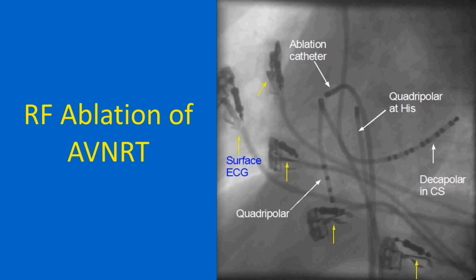The distal electrodes record the potential from the left atrium. One quadripolar catheter is positioned in the region of the bundle of His and another in the right ventricle. All electrode pairs are connected to a junction box and through it to the EP recorder. Recordings from all electrode pairs are displayed on the EP recorder. The right ventricular catheter is also used for the pacing protocols while inducing tachycardia. His bundle electrode pairs are named His proximal and His distal.